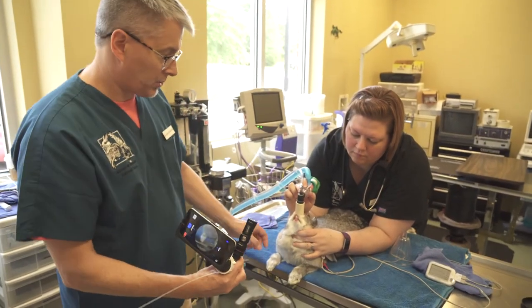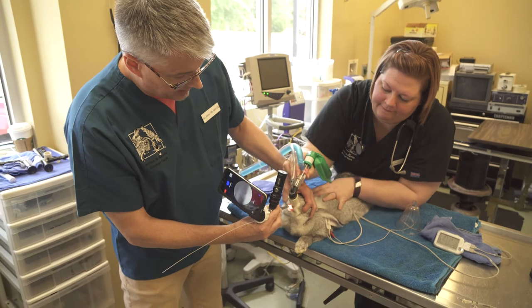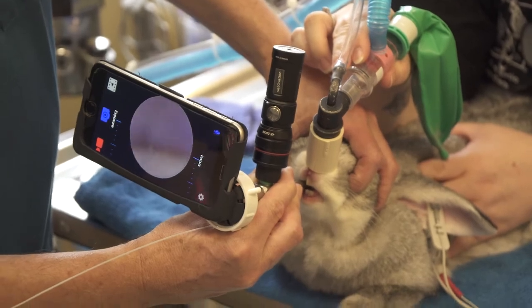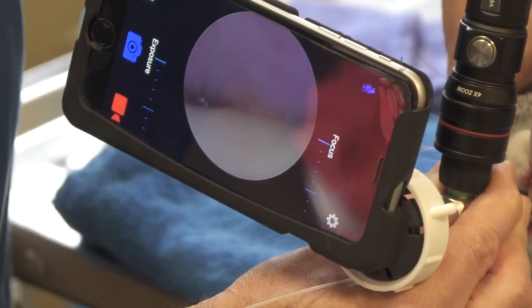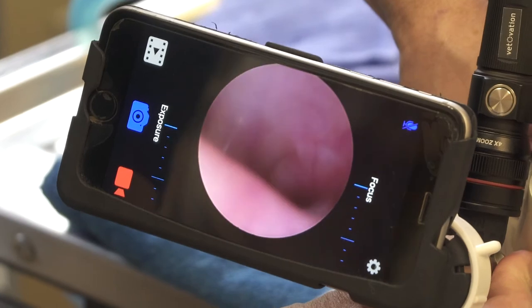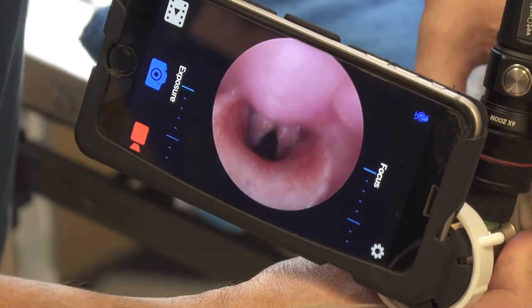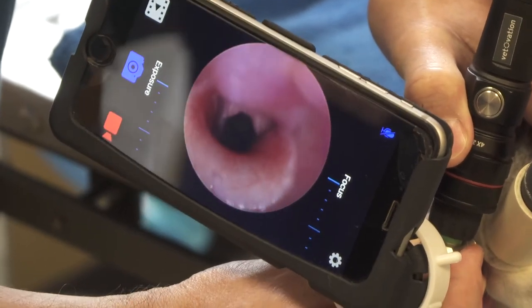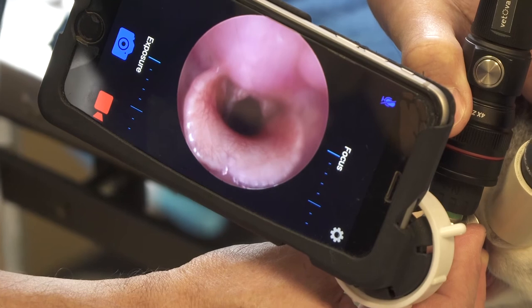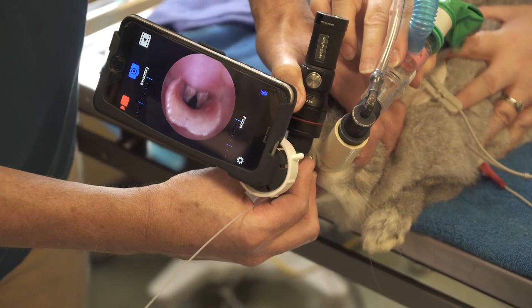We have the rabbit in sternal position with a nasal mask in place. I'm going to come in off to the side of the incisors, and with endoscopy we always go to the dark. Right now I've got the margin between the tongue and the roof of the mouth. I'm going to keep advancing until I find a large opening in the back of the oral cavity. Here I have the glottis positioned right in the center of the screen. We have the epiglottis along the bottom of the screen, and you can see the glottis opening and closing. In the process of coming back here, we have already dislodged the soft palate from the epiglottis.